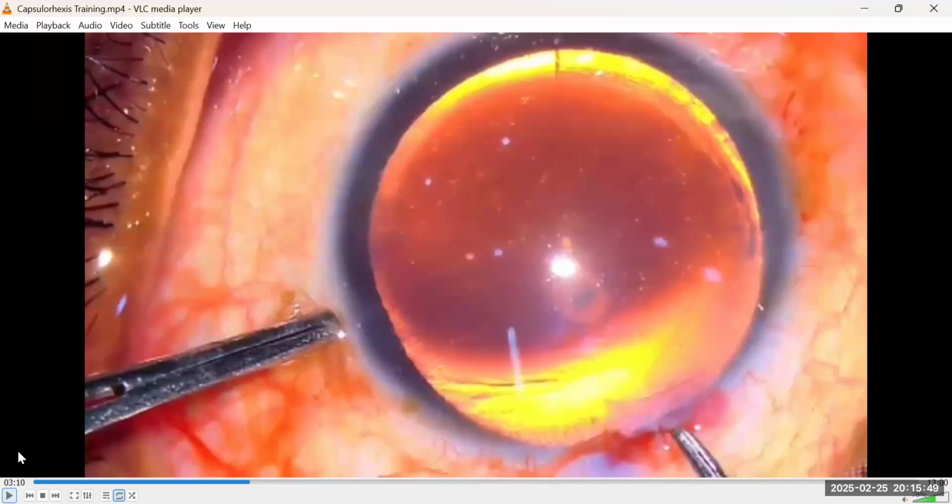We refreshed our minds why we should always, at each one time, overfill the anterior chamber with visco, because of the surgical anatomy of the anterior chamber. The average depth of the anterior chamber, the widest position, is about 3.5 millimeters, which can range from 2.5 millimeters to as deep as 5 millimeters in a highly myopic eye.